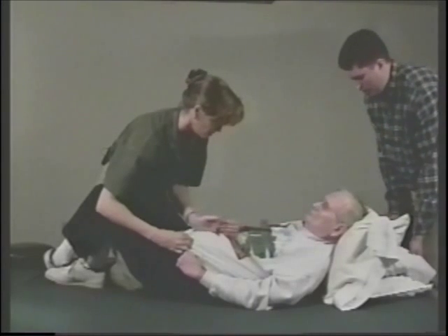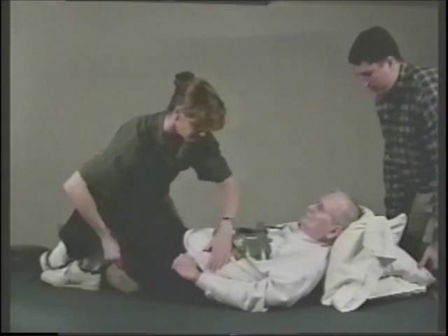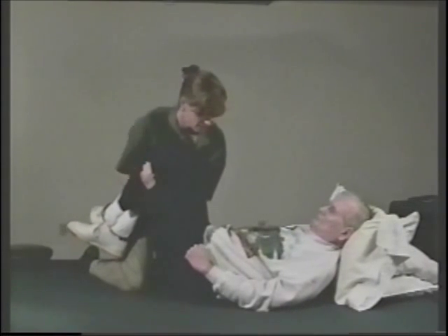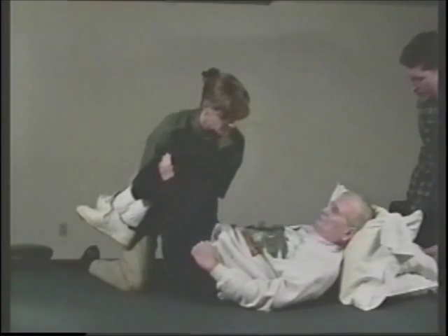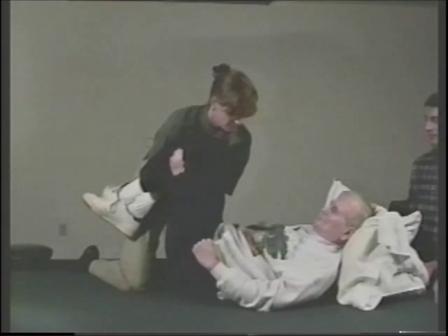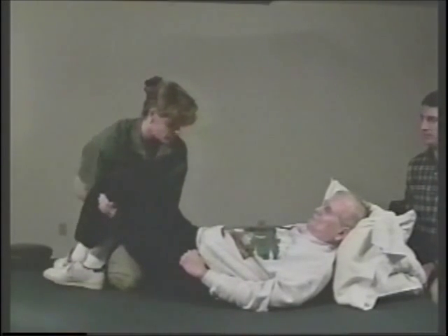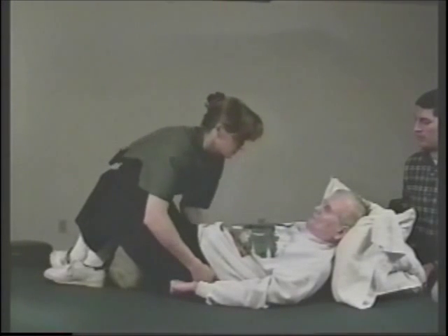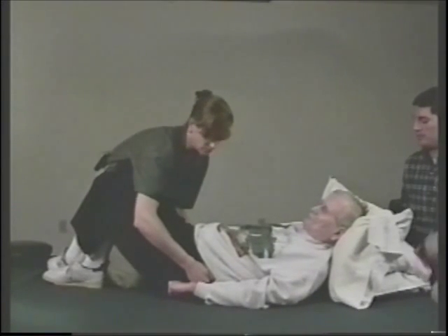We are looking for alignment of the trunk, and looking for pelvic mobility. This would be the posterior pelvic tilt — it has very little range, the pelvis isn't moving very much. Anterior pelvic tilt, which we also have very little of.